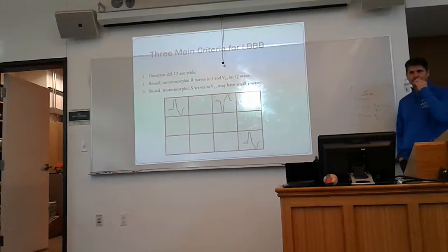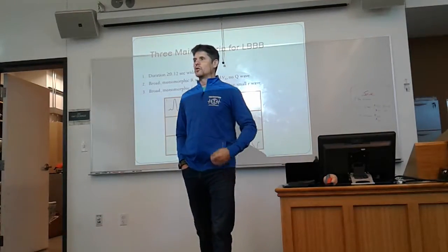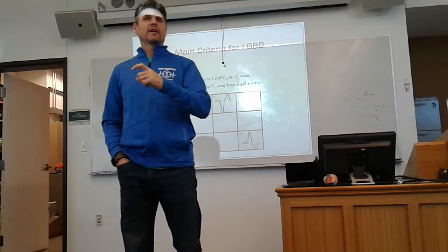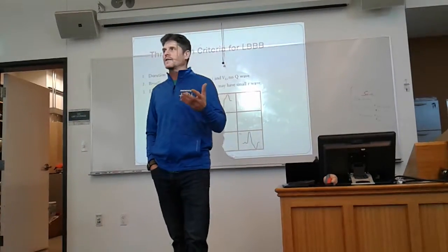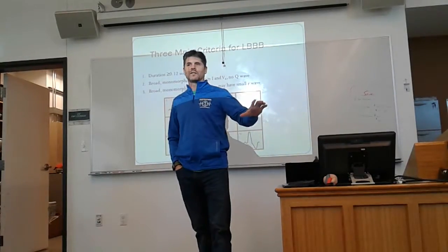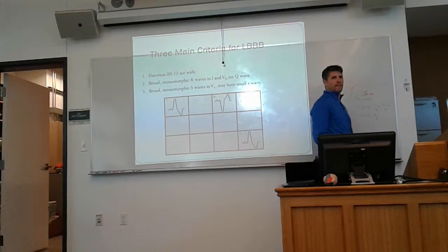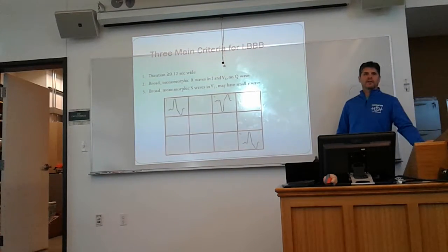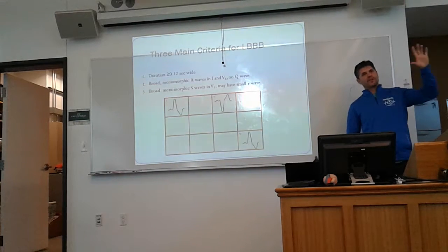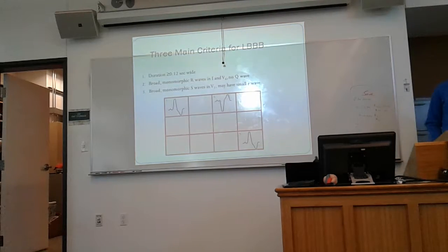You might see weird amplitudes in those precordial leads because you have more electrical activity on average taking place on that precordial side, so you see larger amplitudes than you would normally see. Because it's going cell to cell, the average time that you have electrical activity happening over there is greater. So, things to consider.